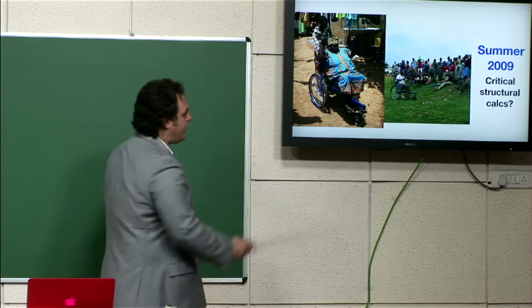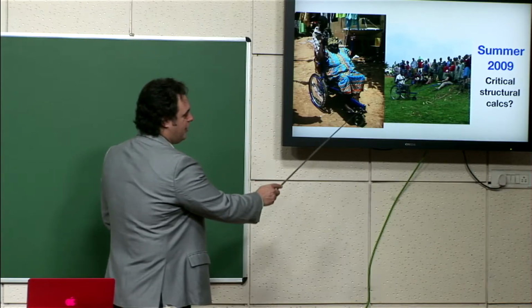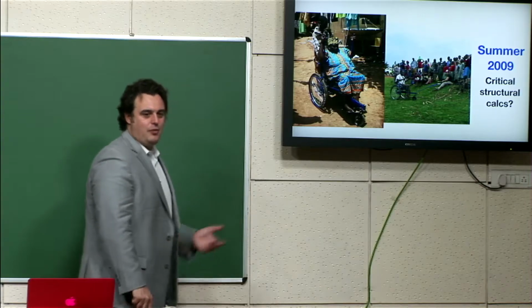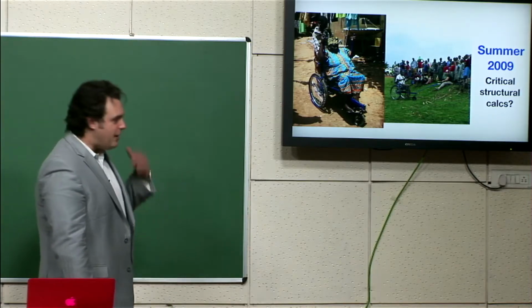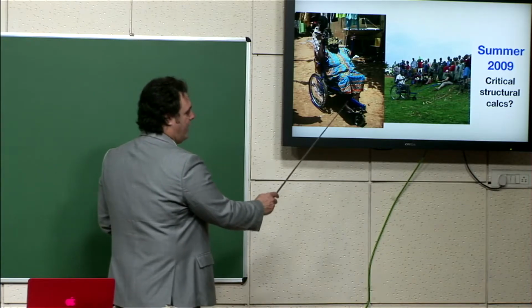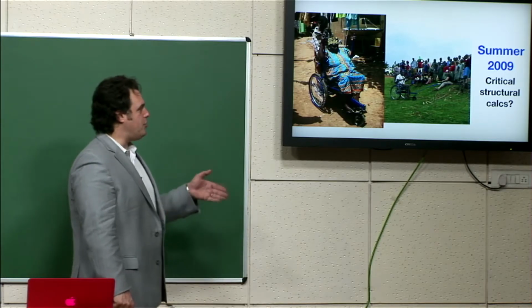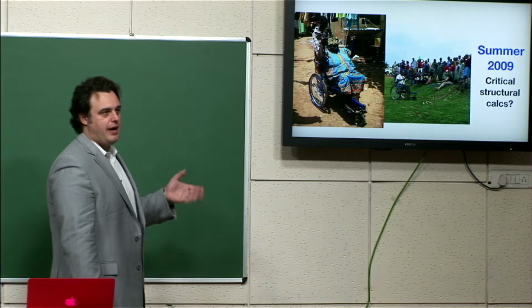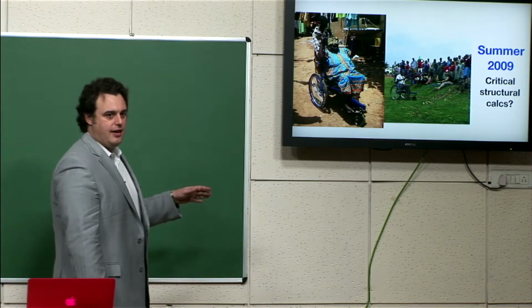And so why did we choose, you see the cross-section of this tube? It's rectangular. Why did we choose that? Yeah, exactly, a high moment of inertia. Right? So we had to think about that. This has a factor of safety of about 5 compared to static loads. So you can put like 1,000 pounds or 500 kilograms in the seat, and the chair is plenty strong enough to handle that.